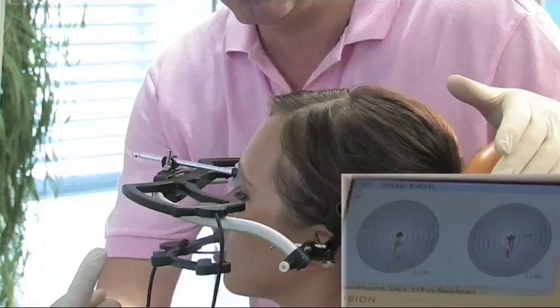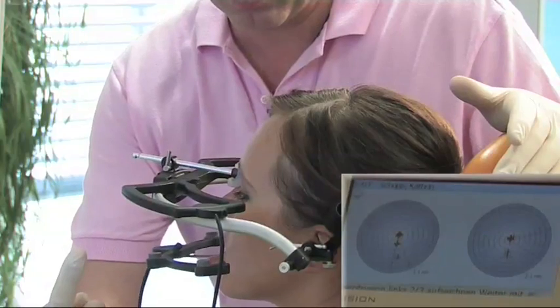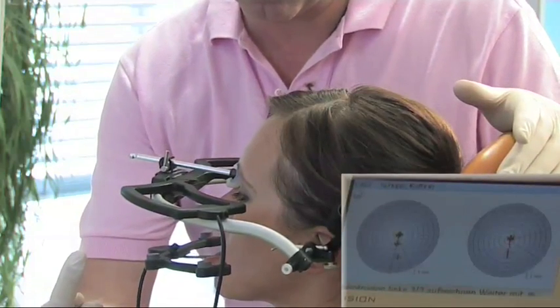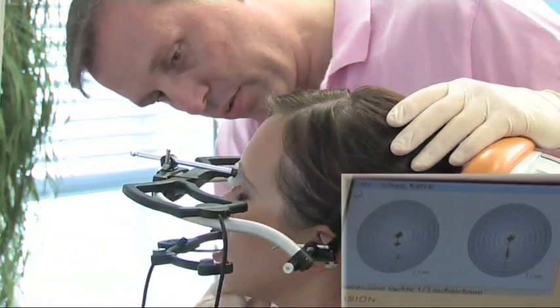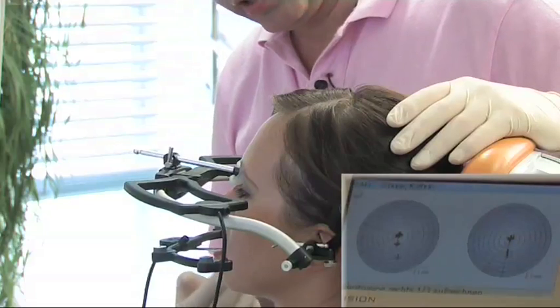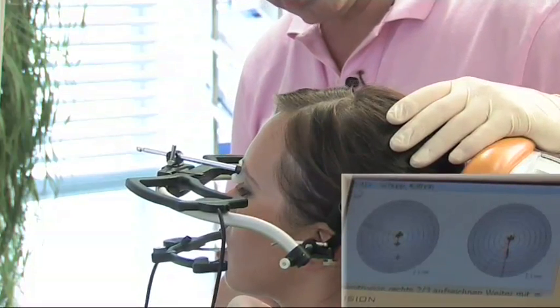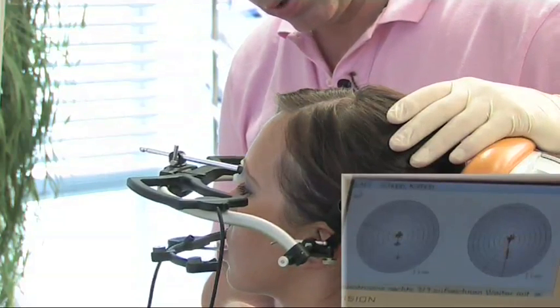Super. Now move here over to the right. Great, and back. Move to the right and back.